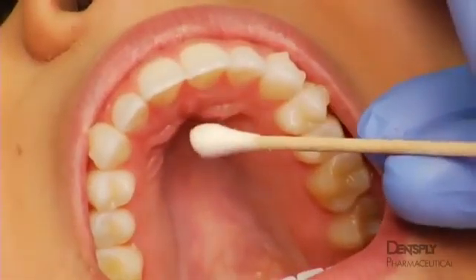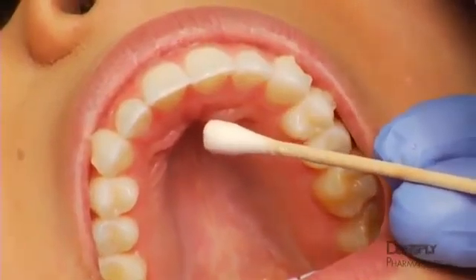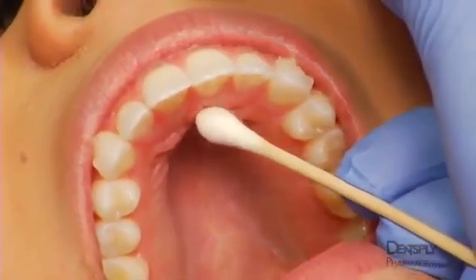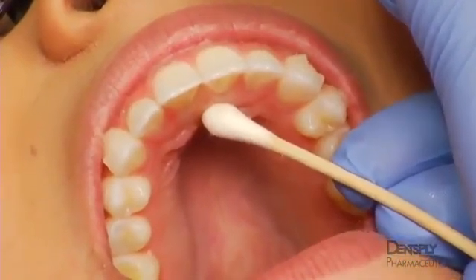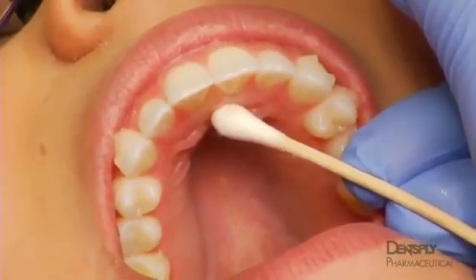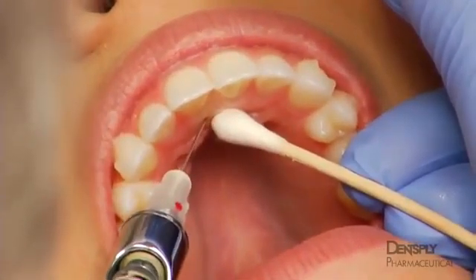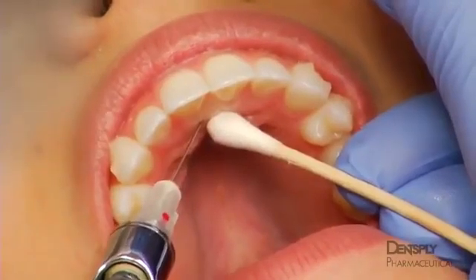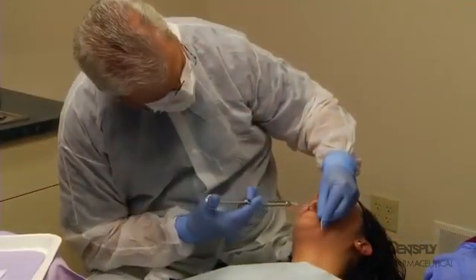Never insert the needle directly into the incisive papilla, because this can be extremely painful. Pressure anesthesia is performed utilizing a cotton-tipped applicator on palatal tissue on the contralateral side of the incisive papilla. Insert the needle into the previously blanched tissue at a 45-degree angle to the palate. Advance the needle until the maxillary bone is contacted and then the injection is administered. Aspirate and slowly deposit 0.45 milliliters of solution, about 1/4 of the cartridge, over 20 to 30 seconds.